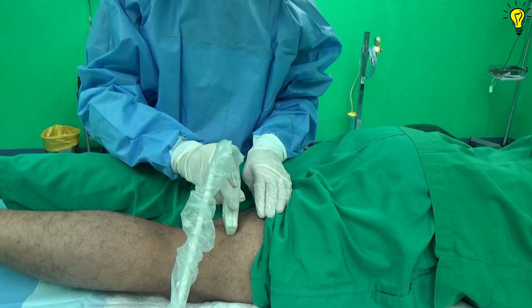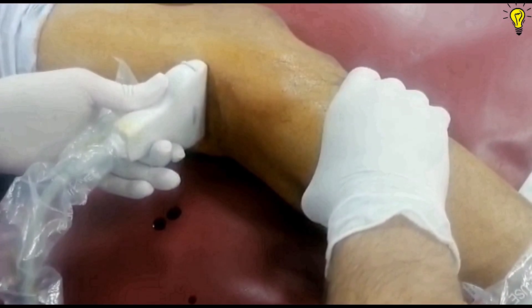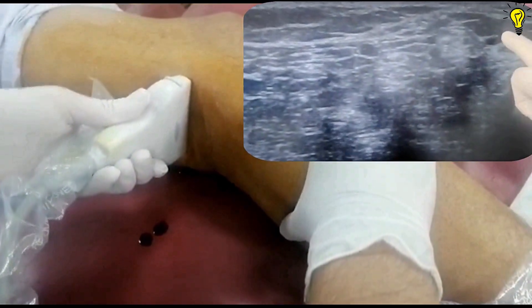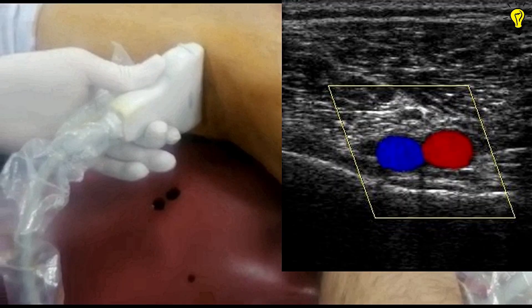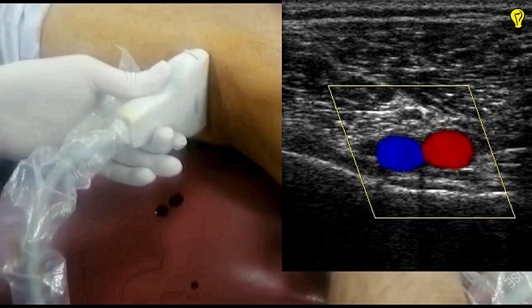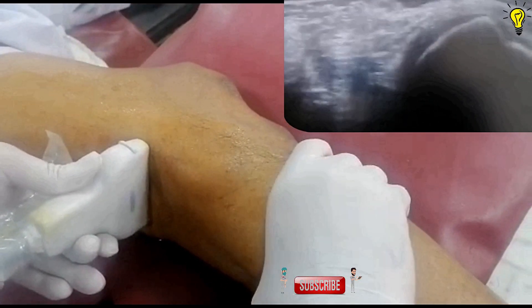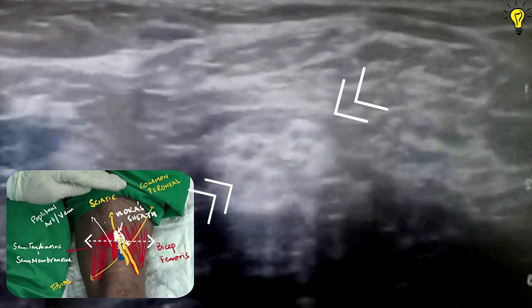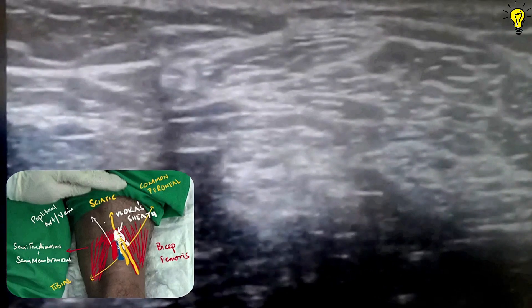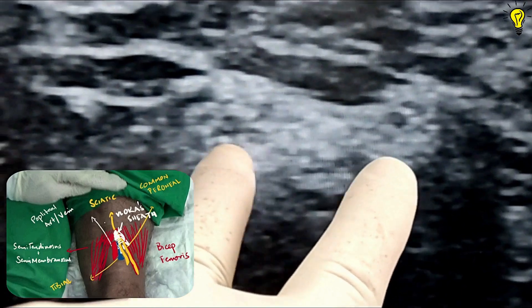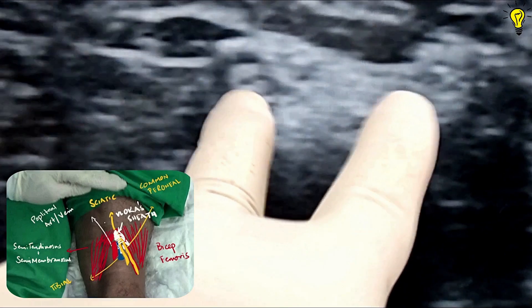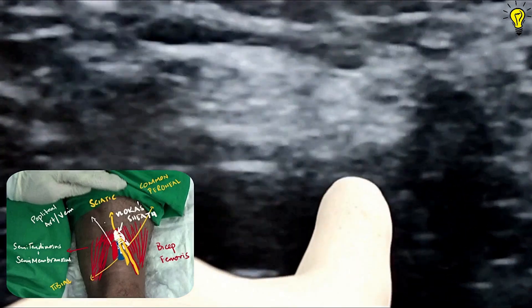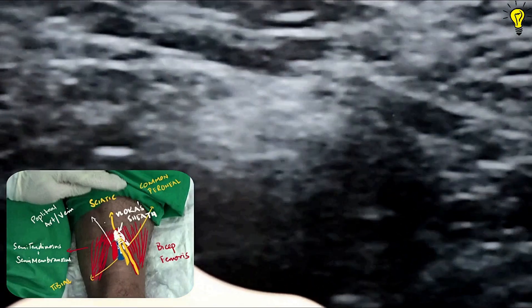Always tilt the probe a little downwards for better visualization of nerve structures. On screen you can see laterally biceps femoris, and medially semitendinosus and semimembranosus. Always identify the artery and vein — use color Doppler, or if unavailable, press and release on the calf muscles to see the popliteal vein opening and closing on screen. Moving the transducer upwards, you see the common peroneal and tibial nerves joining to form the sciatic nerve. Moving the probe distally, we will target the tibial and common peroneal nerves separately, diverging them further by moving the probe downwards.